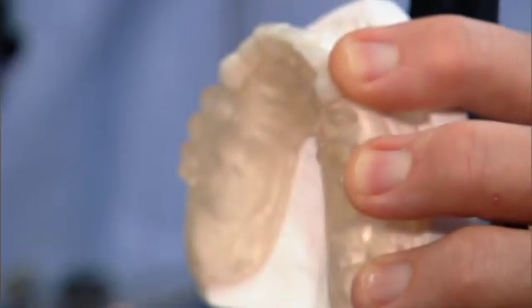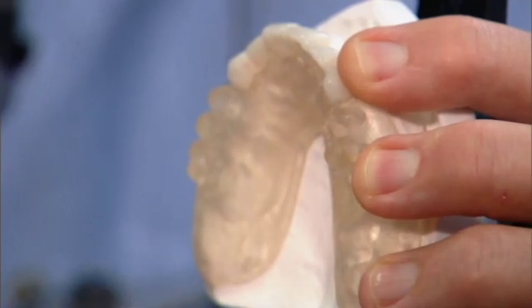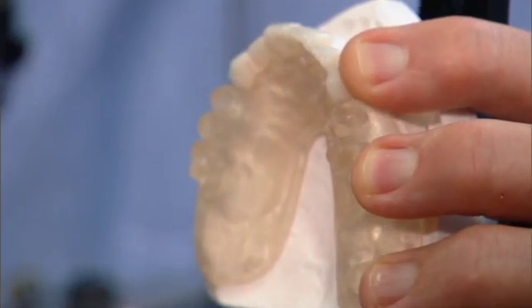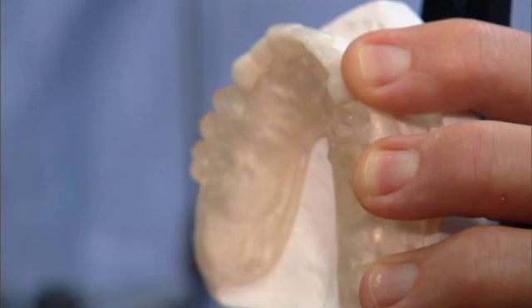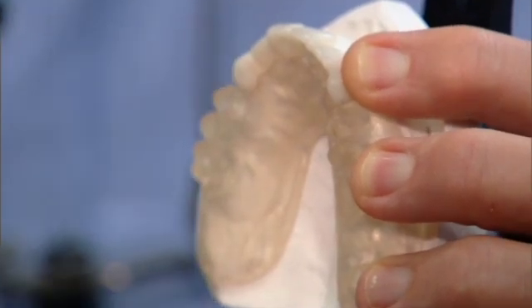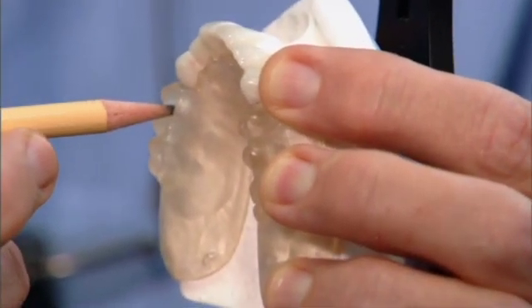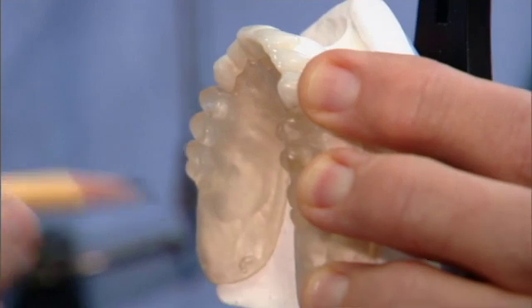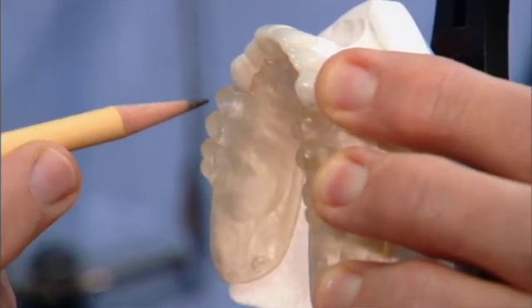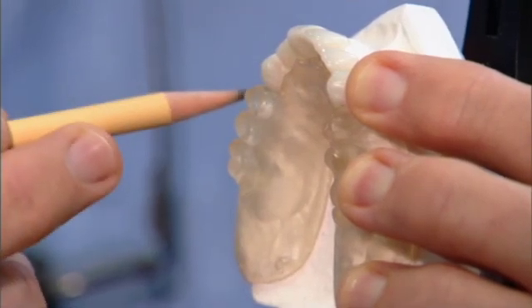Even though we have the existing sockets to help us determine implant position, because we're going to be using this as a rigid attachment for a removable partial, we want to locate our implants in a little different position than we would if we were using it for a crown, shall we say. So what I'd like to do is actually place my implant just a little bit to the distal and a little bit to the lingual, so that when we set denture teeth, my female component of my attachment will have much more room under the lingual cusp than it would if we pushed it out to the buccal.